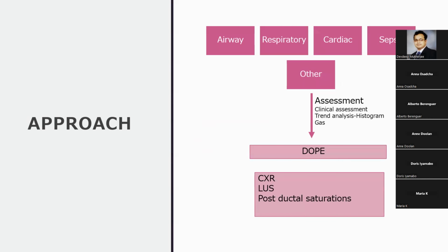As a first point, when we're using lung ultrasound for any kind of diagnostic process, it's really important that we stick to an approach that involves clinical correlation. For any baby who starts desaturating or having low saturations on the ventilator, it's really important from our perspective that we follow a structured approach. The common approach is an ABC approach, where you make sure that your tube or any kind of respiratory support is working effectively, is in the right place, and that the system is not dysfunctional. You don't have a blocked ET tube, or CPAP that's dislodged from the baby's nose.